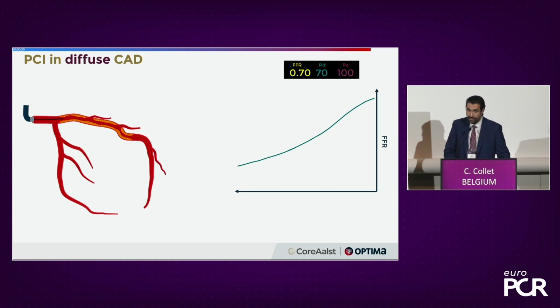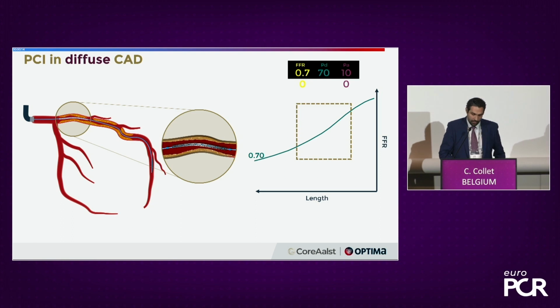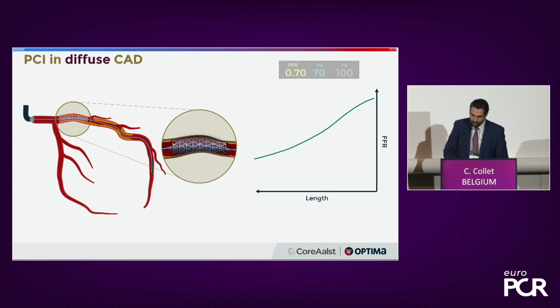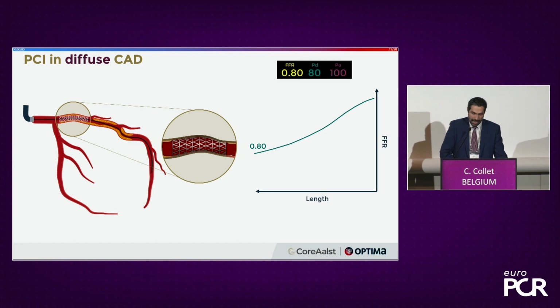The problem is that when we use angiography, we always find a place that says, here's the lesion. Here's the lesion. I can see it very clearly. Here is a more severe one. This is the lesion responsible for the 0.7. So we might end up putting a stent. Of course, it's going to be a longer stent than in the previous case. And what is important is that after we place the stent, if we perform a second pullback maneuver, or if we look at the change in the pullback curve, this is what happens. Look at the curve. It remains diffuse. The FFR might improve a little bit. In this case, it went to 0.8.